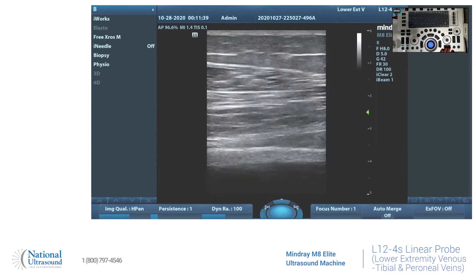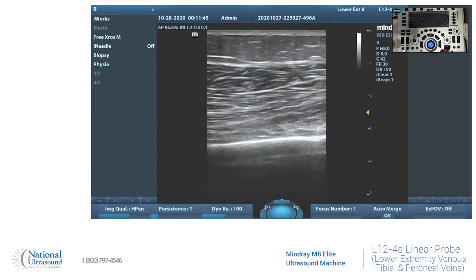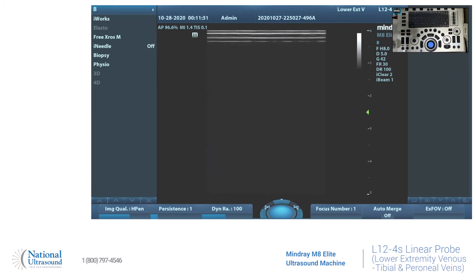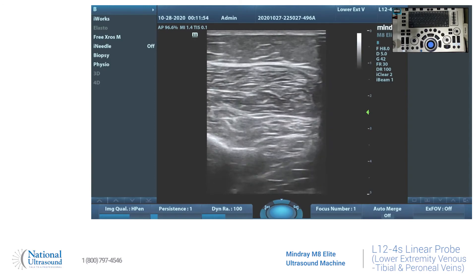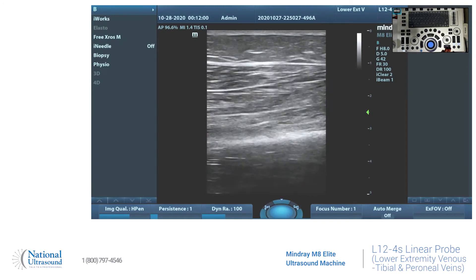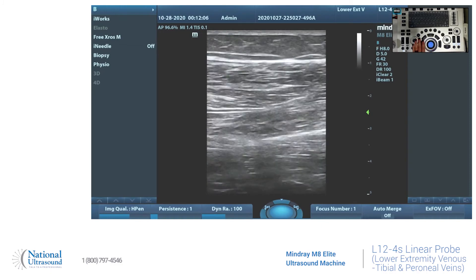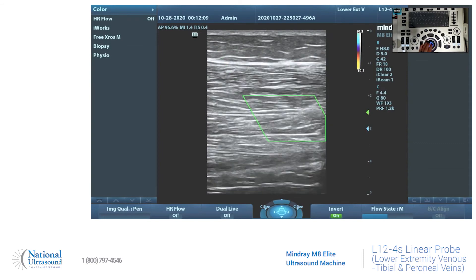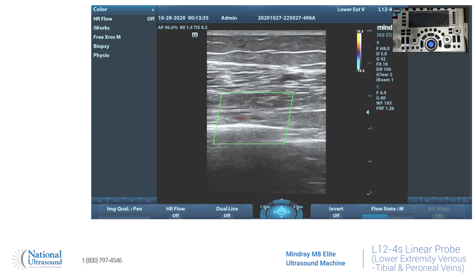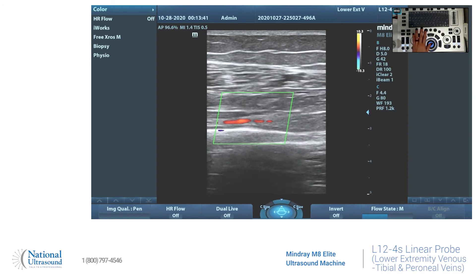Now we're going to take a look at the peroneal vein, so you're going to go a little bit deeper. It's coming in right there. It's the same thing like you'd see it in transverse — two veins to one artery. We have the color flow on showing the peroneal veins: two veins and one artery sandwiched in between.